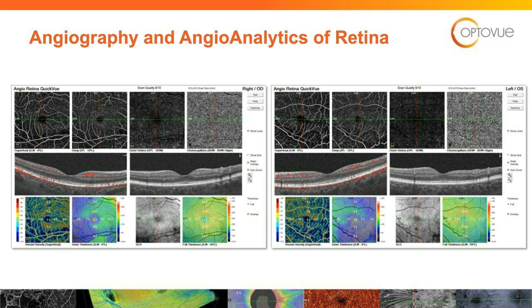This is that same lady. We know that it's worse in the left eye than the right eye. Let's look at the right eye first. Let's not look at the top 4 angiograms and the B scans. Let's go down to the bottom, and you can see again where the tie-dye colors is. You can see where the ganglion cell, that's a retina thickness map, and you can see where the damage is and where the retina is thinned out. But if you just go to the left of that, you'll see where the vessel density is thinner there, that big blue lake, and it just matches up.